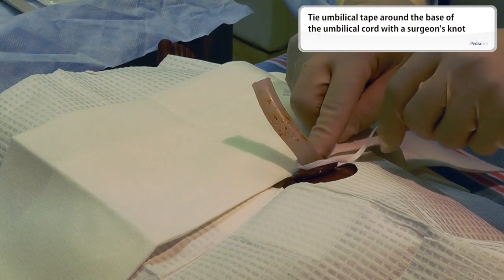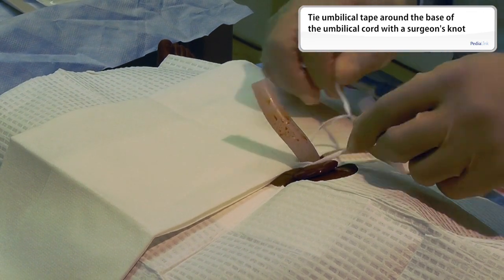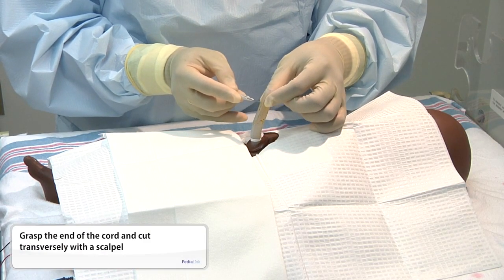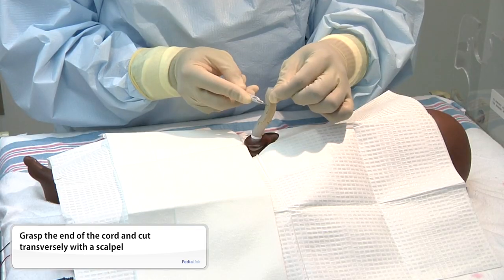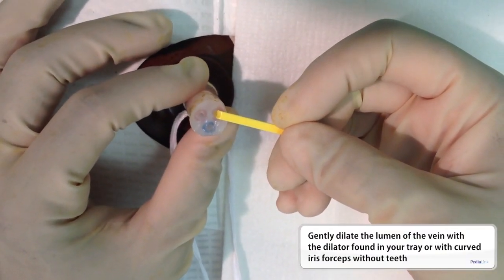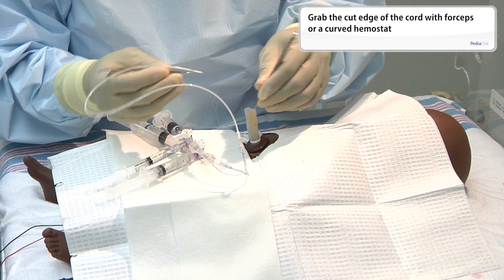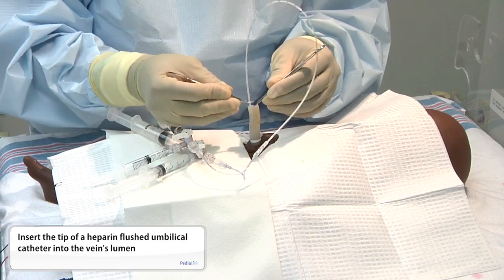After the patient has been draped, tie umbilical tape with a surgeon's knot at the base of the umbilical cord in order to provide hemostasis and to serve as an anchor after line placement. Grasp the cord with your fingers or forceps and cut transversely with the scalpel. This will allow you to identify the umbilical vessels. Using a dilator, which is often found in the insertion tray, gently dilate the lumen of the vein. Next, grasp the cut edge of the cord with forceps or a curved hemostat. Then, insert the tip of a previously heparin-flushed catheter into the vein lumen.